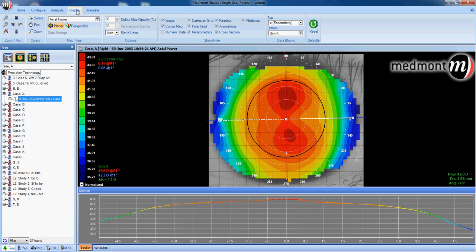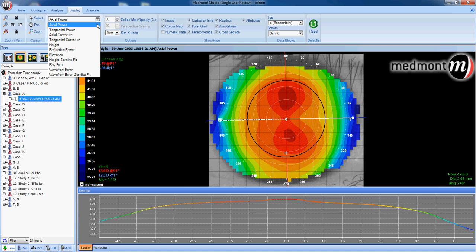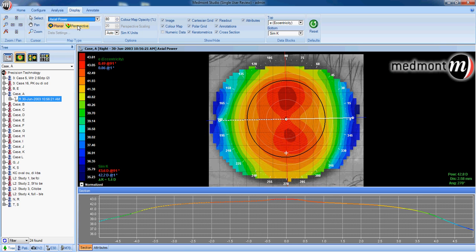With your display window open, we have a number of different analysis options that we talked about in video five: axial, tangential, refractive, elevation, and others. When you're getting started with your Medmont, it may be recommended to use axial power as a way to interpret your corneas.